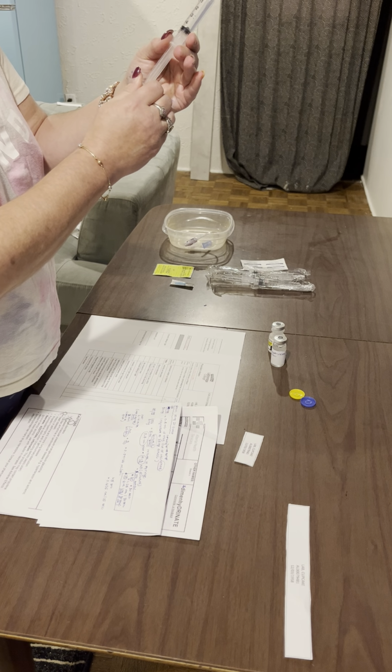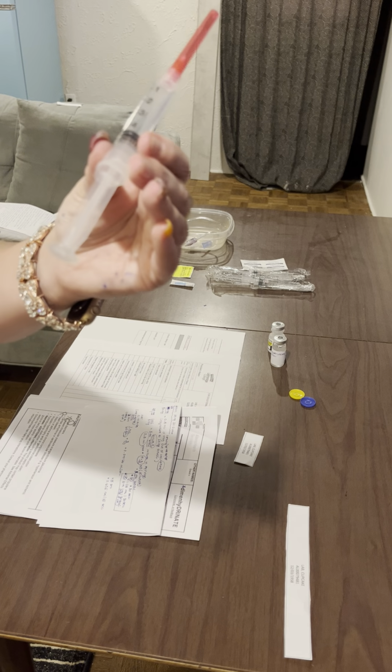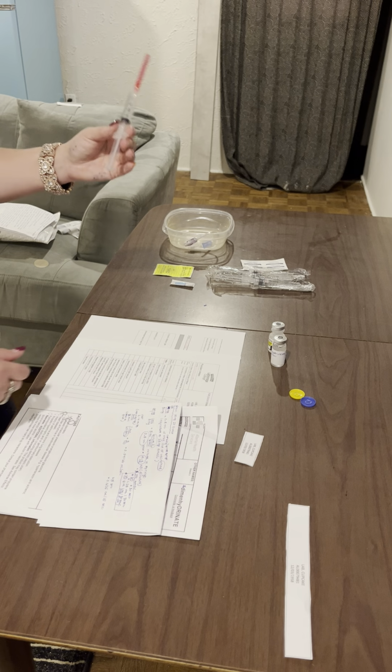And once I get it here, I'll show you. Okay. So I will show the camera that we've drawn back 4.5 air. Just move my fingers. Hopefully you can see. I'll bring it out. So again, 4.5 air. Okay.